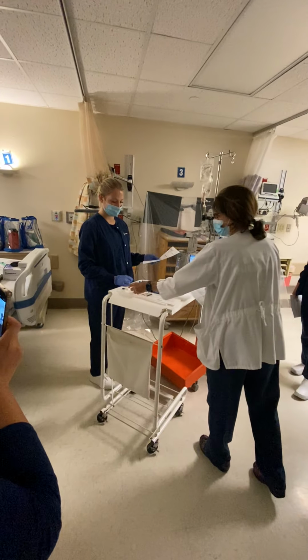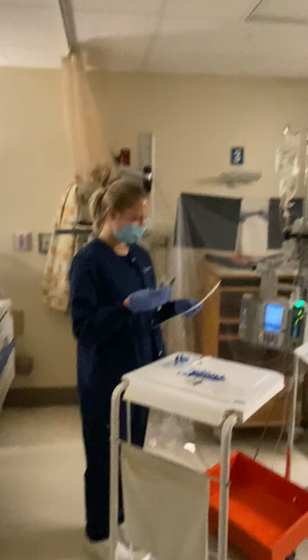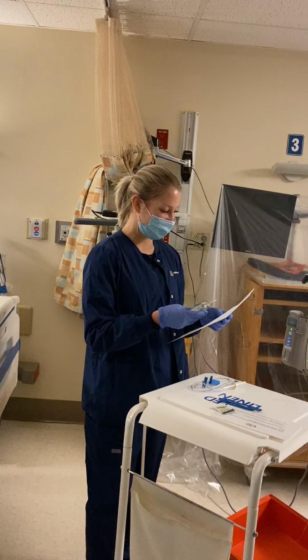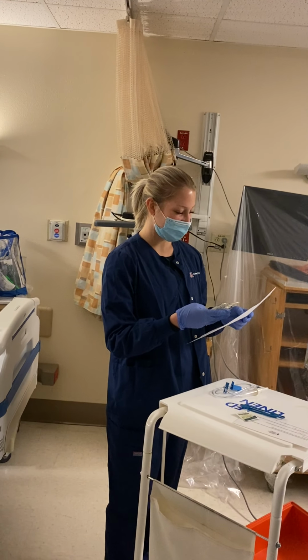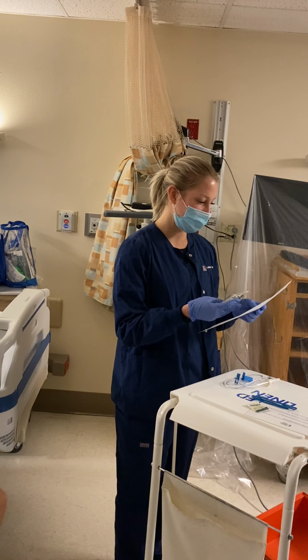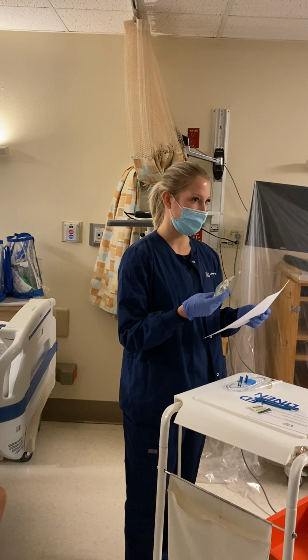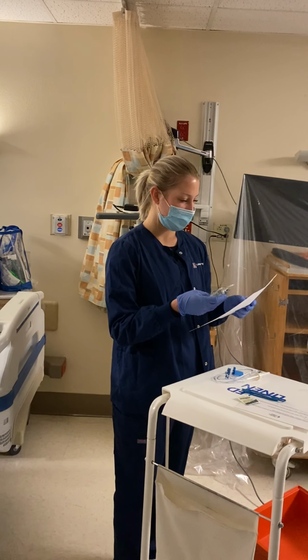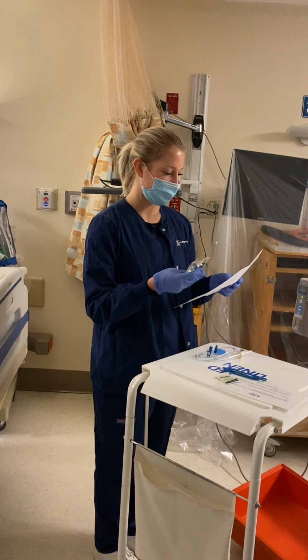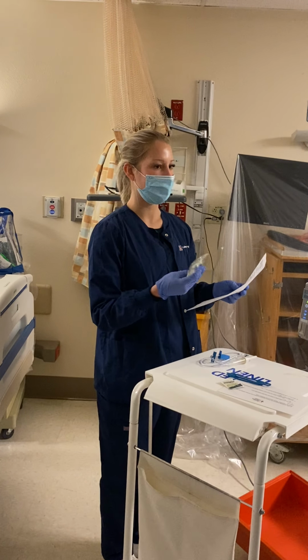Then you're gonna do your check with your clindamycin, so go ahead and do that. Okay, so the right drug is clindamycin. This is so forward, but that's okay. And then the right dose is 700 milligrams in 50 milliliters NaCl. And then the right time is every 12 hours, but I'm administering it now. And then the right reason would be it's an antibiotic. And then the right route is IV.